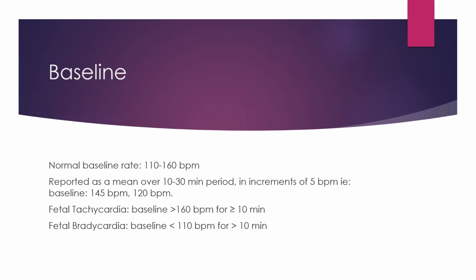The other thing is that the fetal heart rate is always going to be measured in increments of 5. So you're never going to see a fetal heart rate that's 147. You're never going to see a fetal heart rate that's 123.